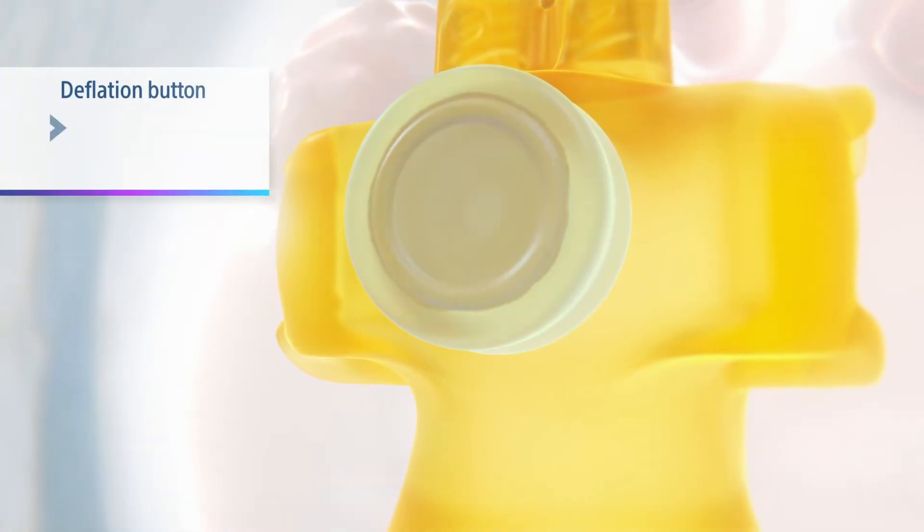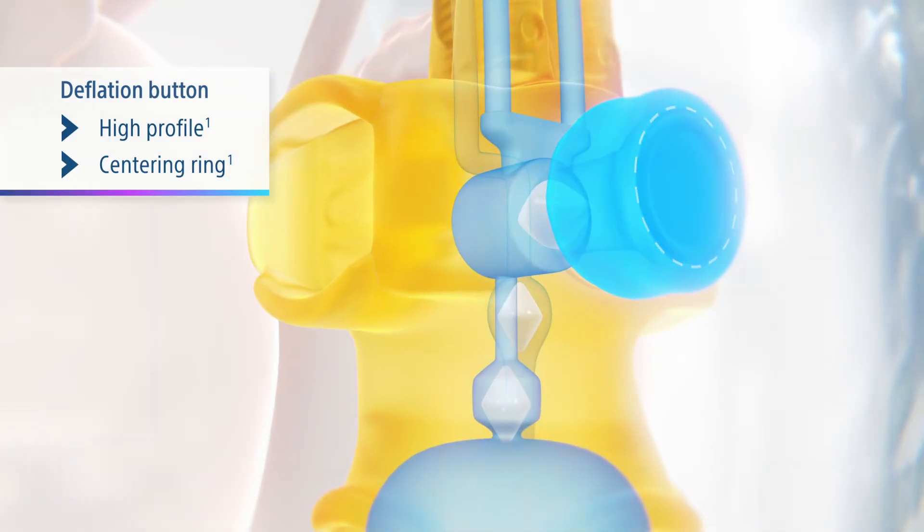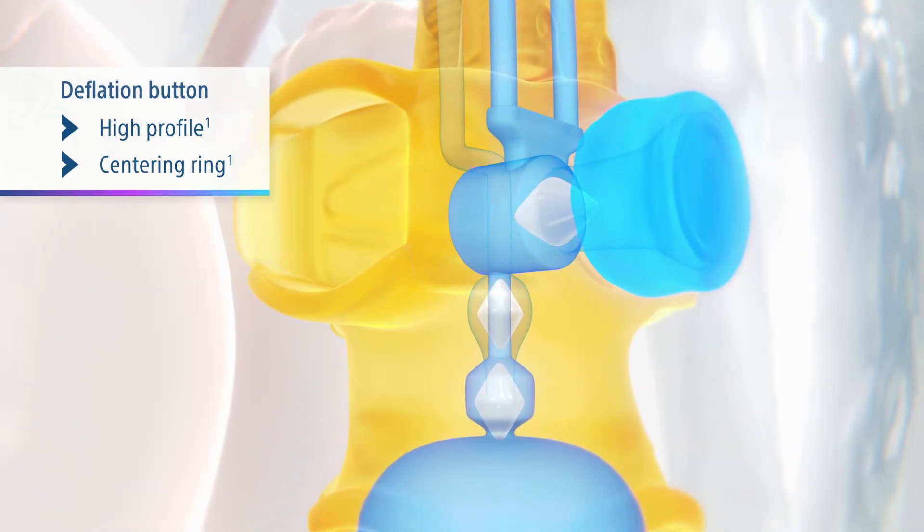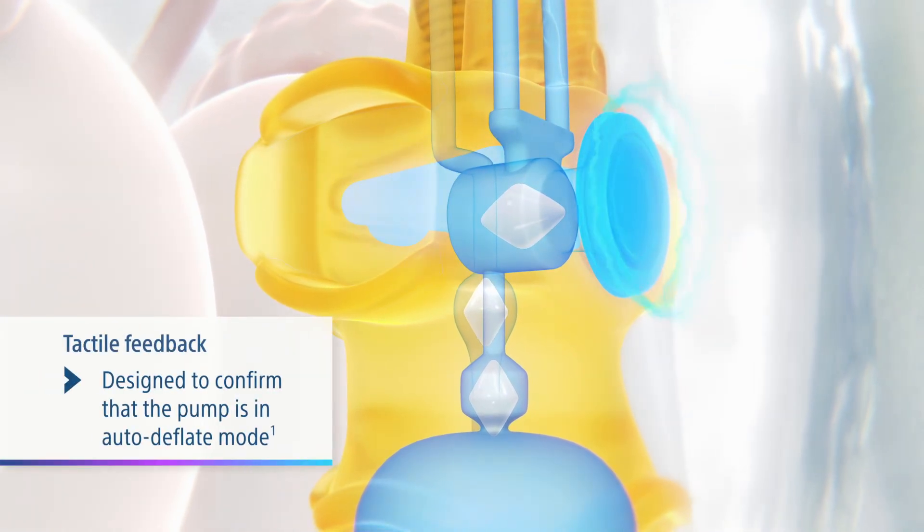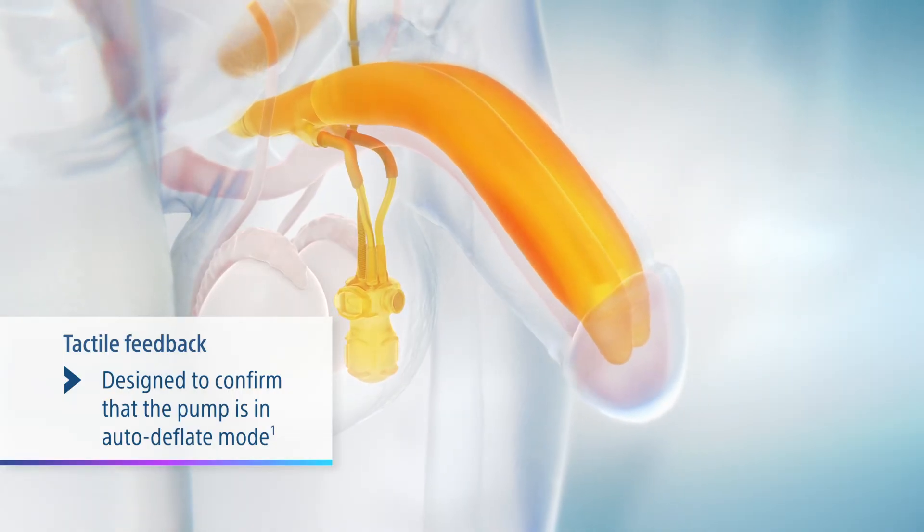The high-profile one-press release deflation button is designed for ease of identification and can be pressed off-axis, which is intended to make it more accommodating for one-handed operation. And the tactile feedback is designed to give patients confidence that deflation has started.